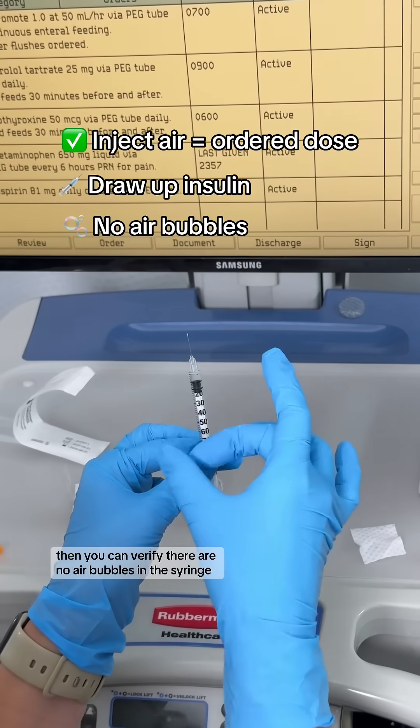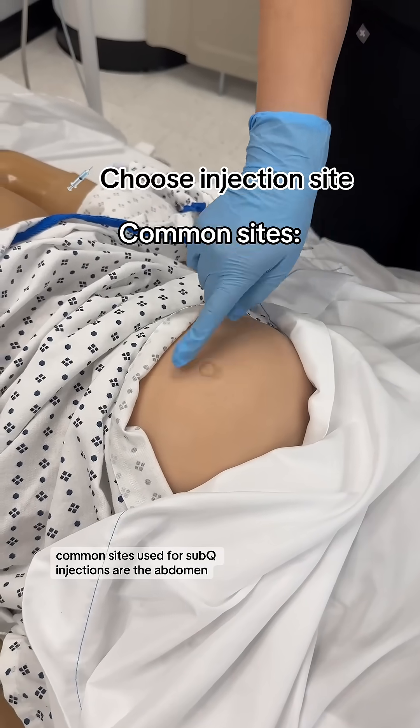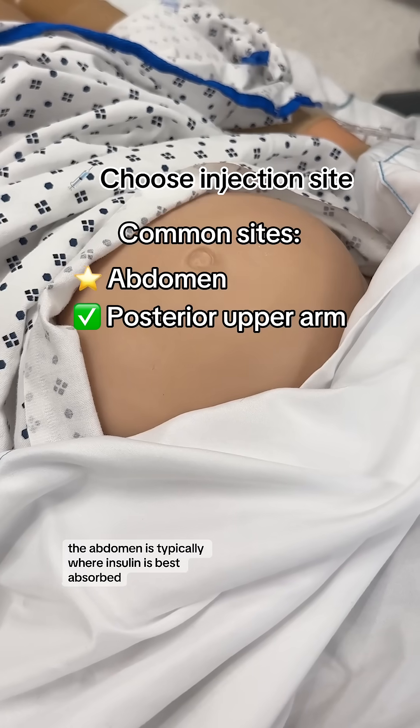Then you can verify there are no air bubbles in the syringe. Then we'll choose our injection site. Common sites used for sub-Q injections are the abdomen and the back of the upper arm. The abdomen is typically where insulin is best absorbed.